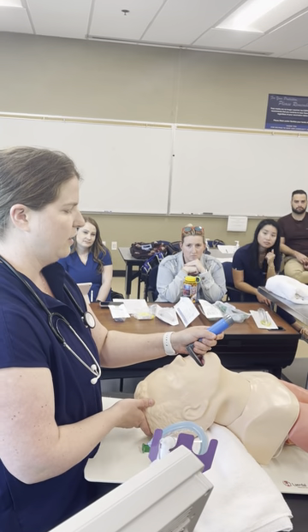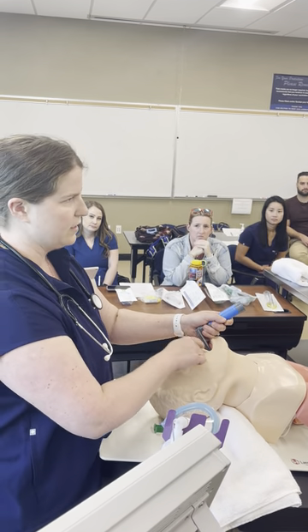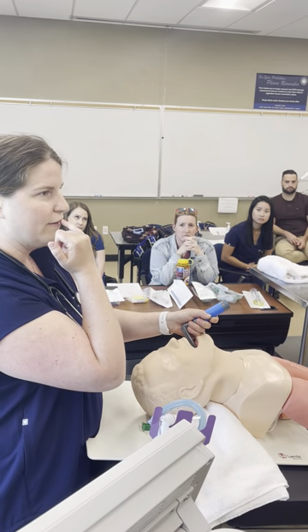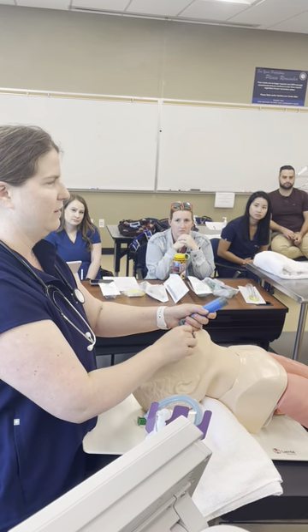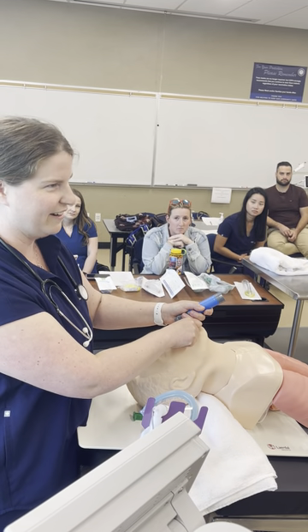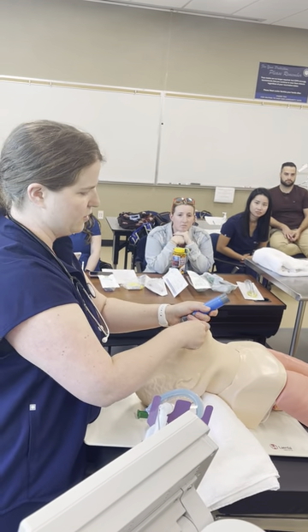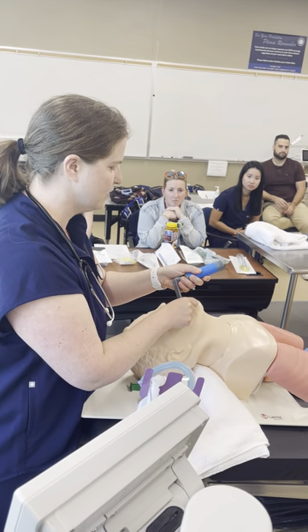During intubation, sweep the top lip so you're not pinching it between your blade and the teeth. A fat upper lip is a very common outcome from novice laryngoscopists — it's easy to forget to sweep that top lip out of the way. Do your scissor, sweep the top lip, then bring your blade in very slowly.